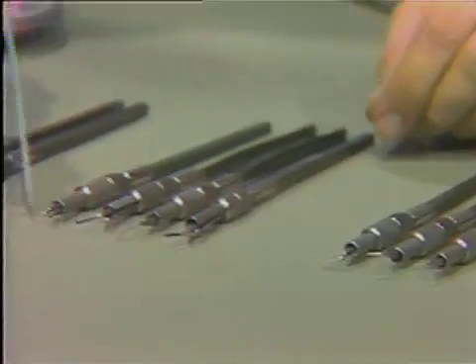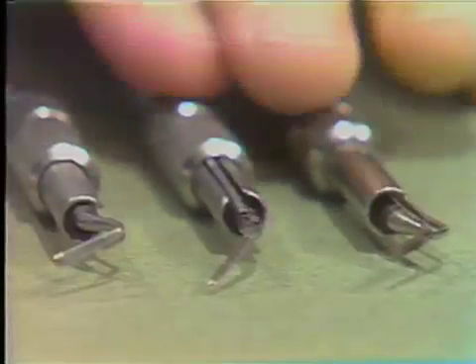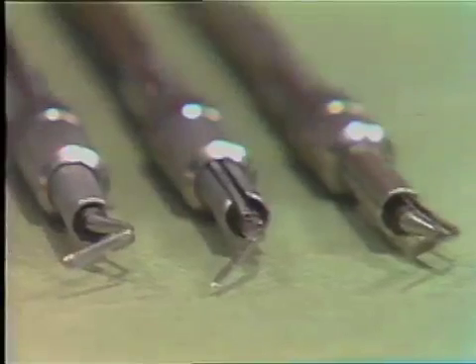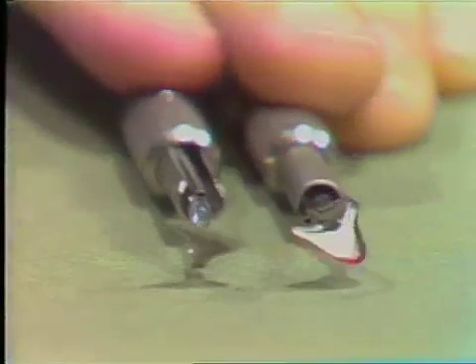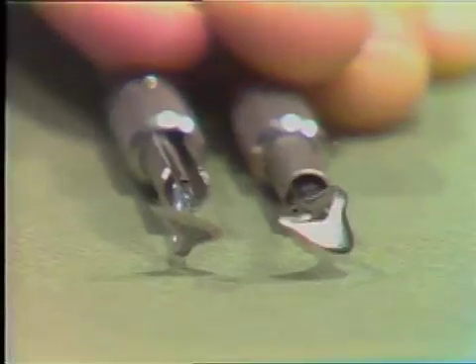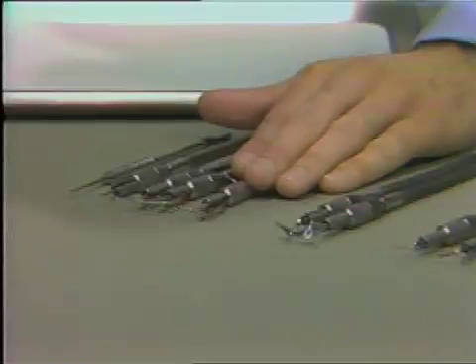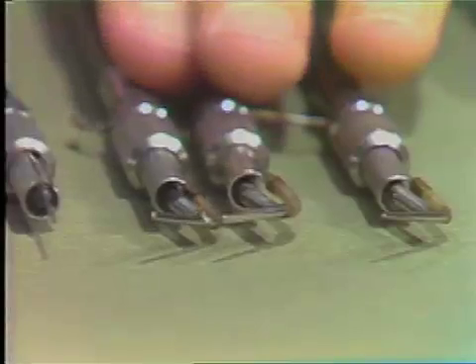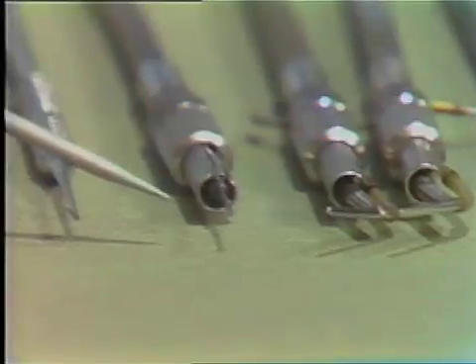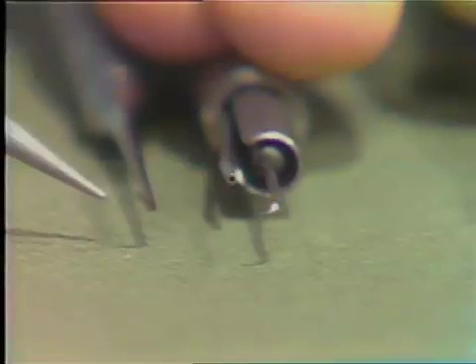Moving down the list of instruments, these instruments are quite analogous to an ordinary periodontal file. The next instruments in line are designed after the Kirkland periodontal knives and are also designed to vibrate in the Cavitron instrument. Moving further down, we have instruments designed for use in the anterior portion of the mouth, and the last two are designed after the 2S instrument in your kit, alongside the standard 2S hand scaling instrument.